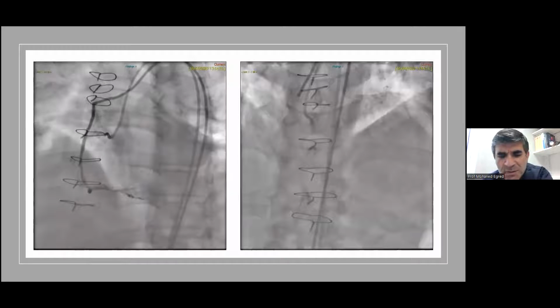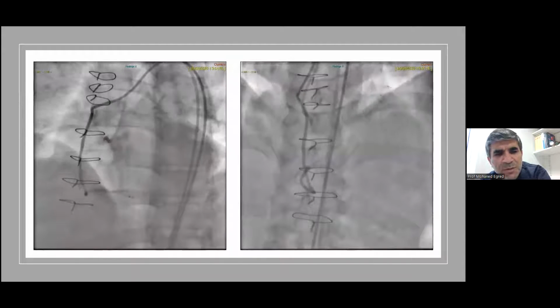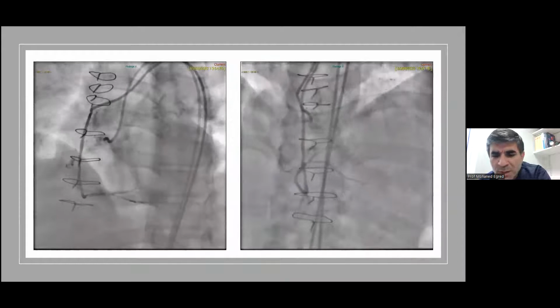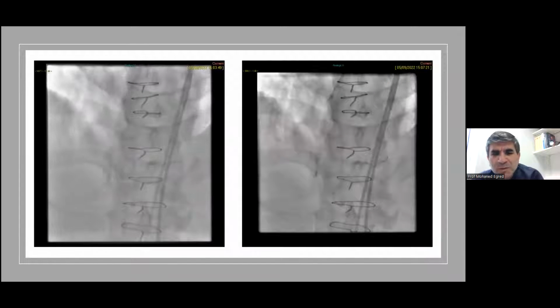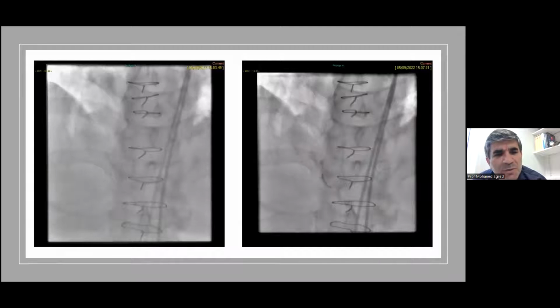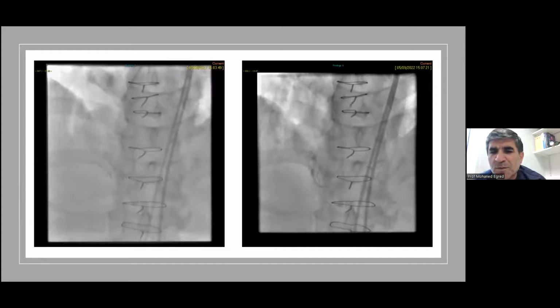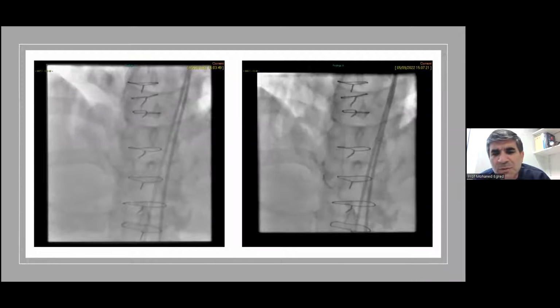As you see, this is the setup shot, and this is a guiding catheter into the vein graft. Because still it's diseased, but it is patent with the stenosis where the balloon was used. And we went to the retrograde approach. The occlusion area was probably about 20-25 millimeters and heavily calcified. We managed to cross retrogradely, but the retrograde wire would not go. So we injected through the tip of the microcatheter just to see what we're dealing with. And you could see how much calcification, even without injecting the dye.